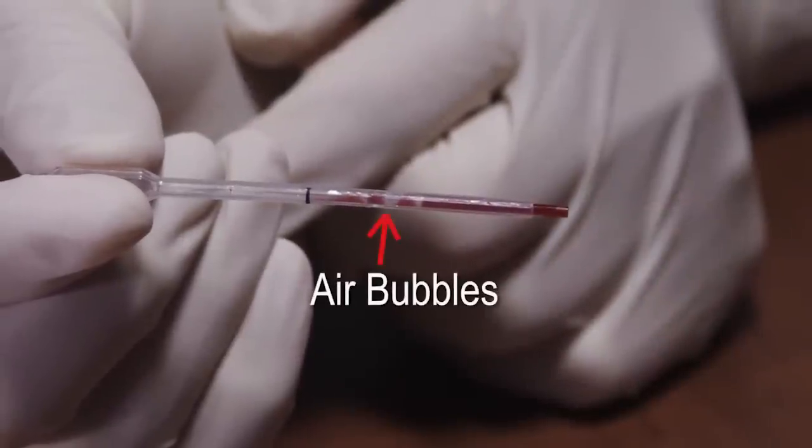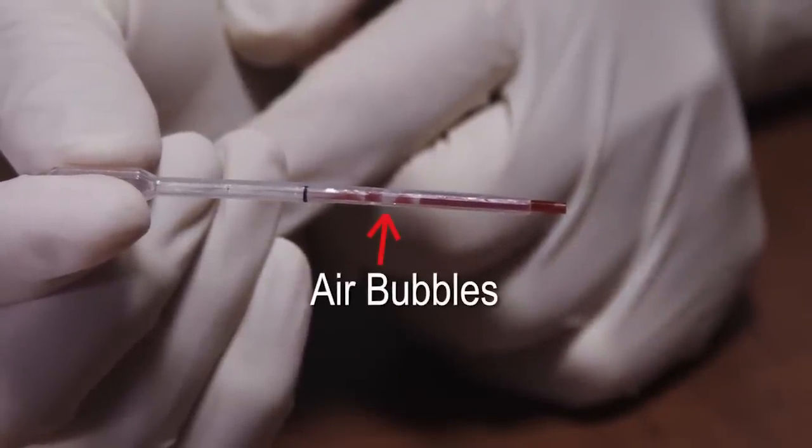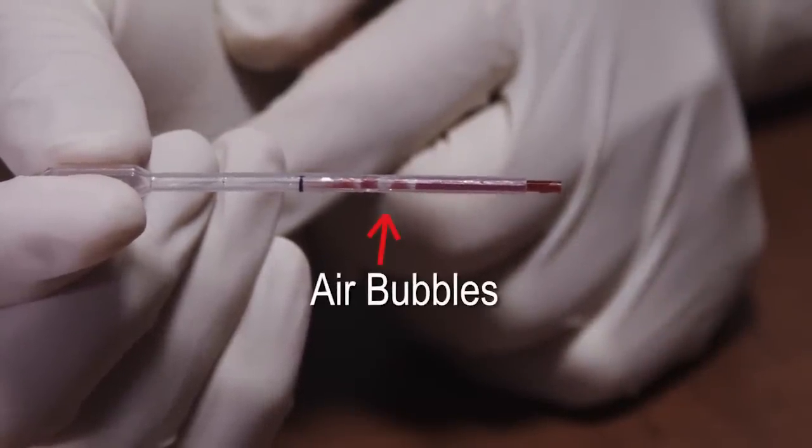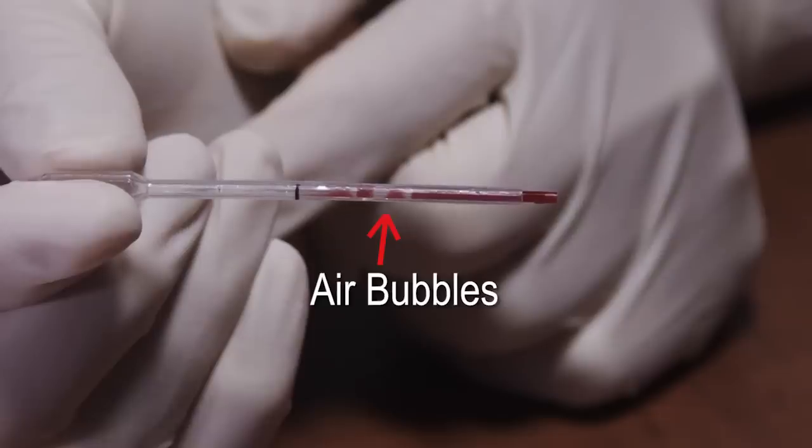If an air bubble is seen inside the transfer tube, perform another finger stick and repeat the previous steps. Do not attempt to aspirate the sample by squeezing the bulb.